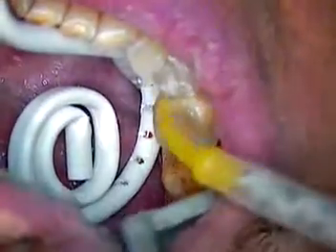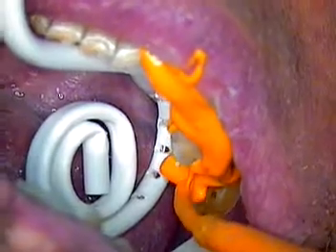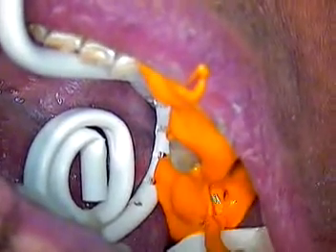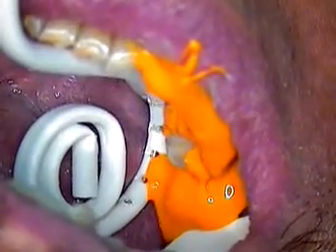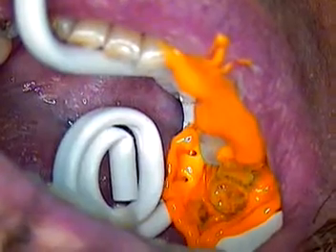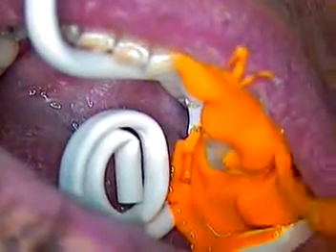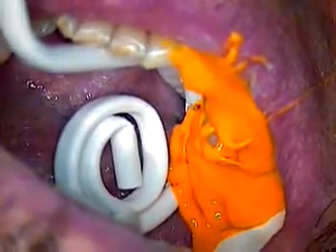This is fast set, so as soon as my dental assistant starts mixing, so will I. I'll be injecting the material — I'll go up in here first, extrude some, then come around the tooth 360 degrees. I am going to displace that slightly. All right, Pierre, you can go ahead and close all the way down. In about three minutes we'll know what we have. This is Dr. Jerry Cuomo — I'll show you the impression when we're done. Take care.